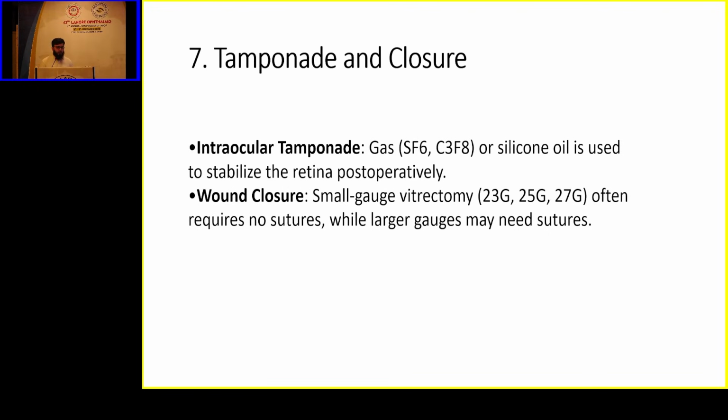So tamponade and closure depend on the pathology. The more severe the diabetic retinopathy, the longer the tamponade should be applied. So the longer tamponade is silicone oil, the shorter is gas, SF6 or C3F8. Wound closure is important in diabetic retinopathy because healing is slow in diabetics.